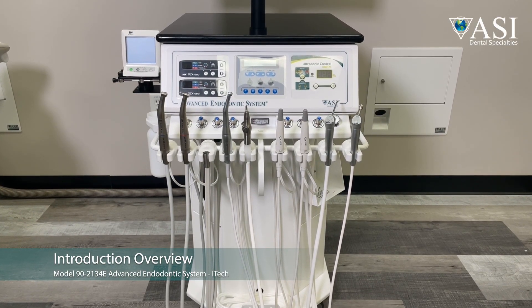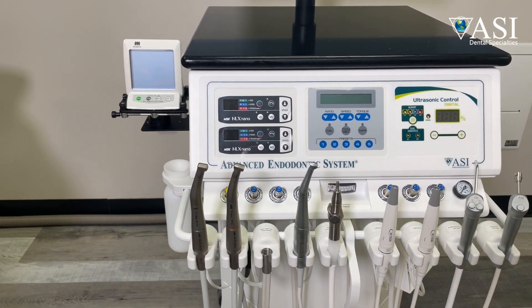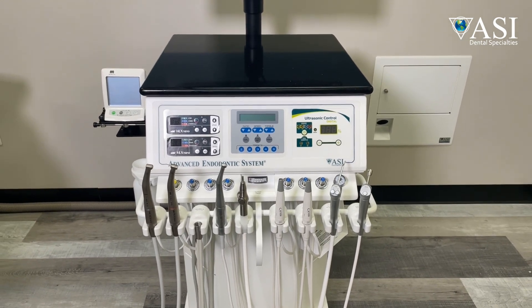This is ASI's Designer Series iTech Advanced Endodontic System, Model 90-2134E. Endodontists choose this model because of how it streamlines your office technology by accommodating your computer monitor with the internal CPU compartment of the cart.